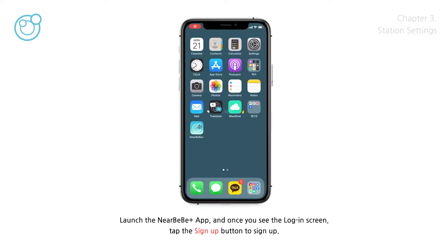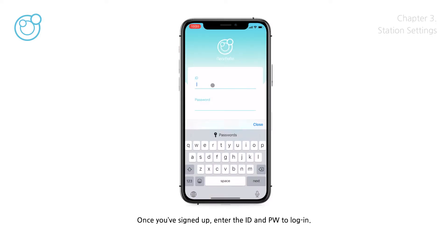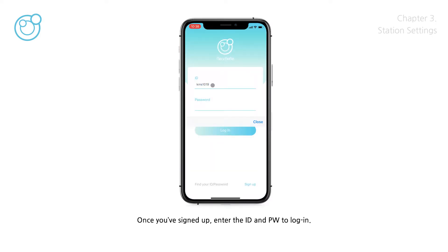Launch the NearBeBe Plus app, and once you see the login screen, tap the Sign Up button to sign up. Once you've signed up, enter the ID and password to log in.